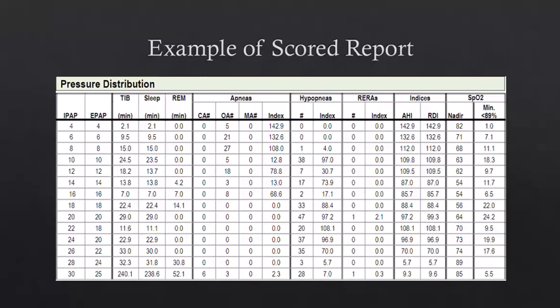Slow down. You can always do a down titration as well. Your ending pressure isn't necessarily the optimal pressure, and pay attention. Make sure that the patient truly is treated and what type of events are happening. Make sure you don't knock your patient's drive to breathe out.